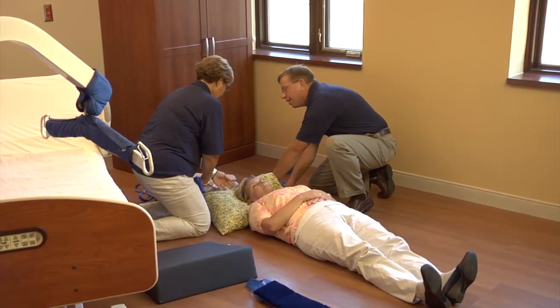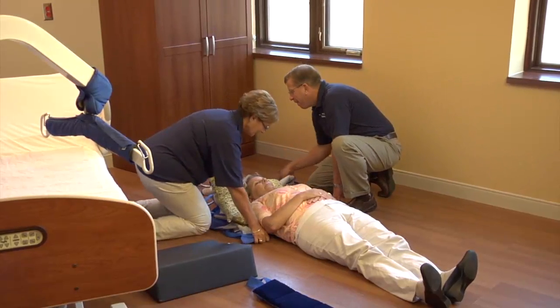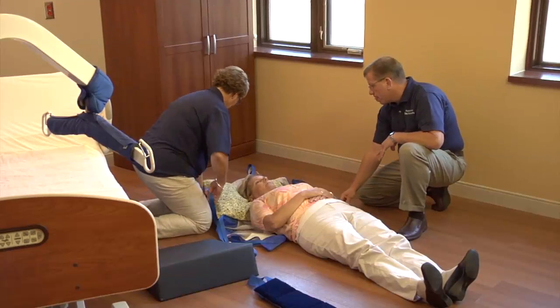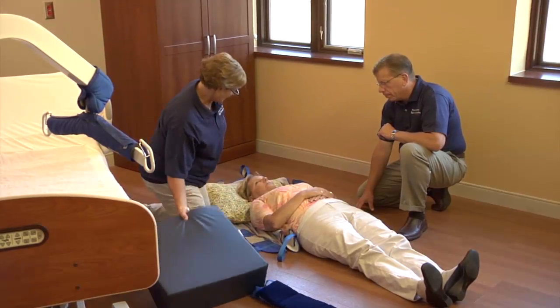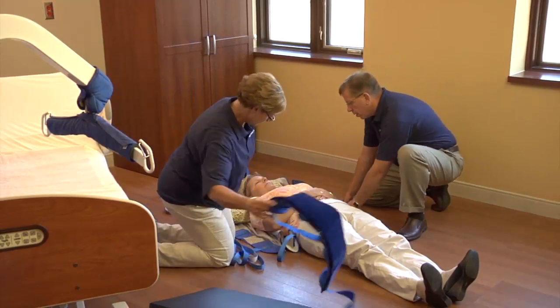Getting the right sling, getting the lift, there are enough people to help get ready for the transfer. In acute care or any setting where a patient may be having a cardiac arrest, the best place to start that intervention would be on the floor. And so again, we never problem solve by manually lifting that patient off the floor.